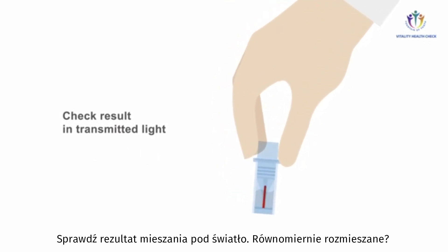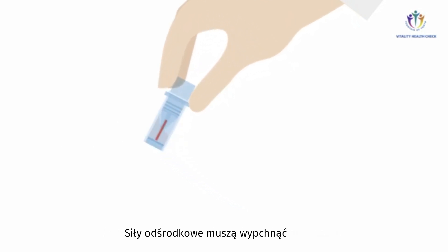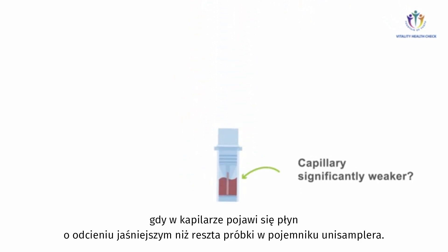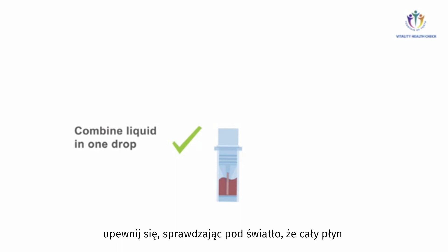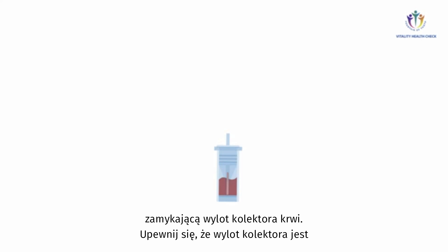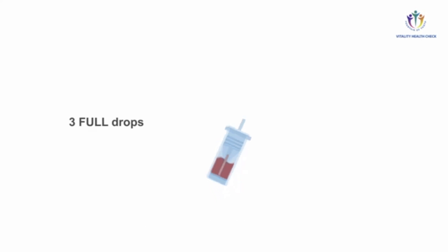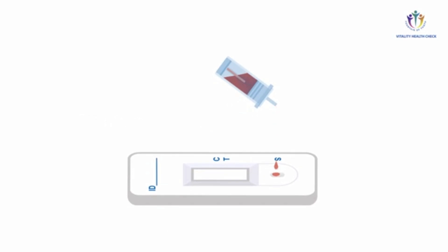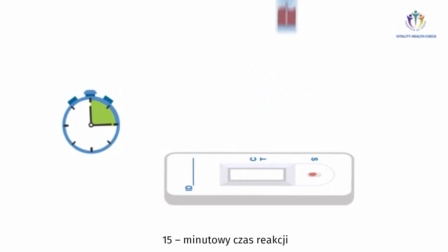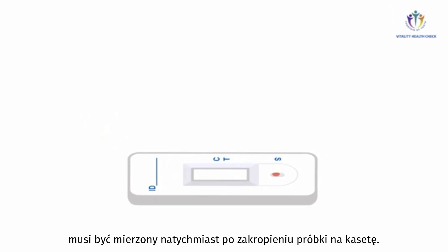Check the result in transmitted light — evenly mixed? Repeat mixing until this is achieved. Complete mixing is achieved once the liquid in the capillary appears stained weaker than the premix at the bottom of the collection tube in translucent light. Once mixing is complete, make sure all liquid is combined in one drop at the bottom of the collection tube. Remove the cap of the blood collector covering the sample outlet and verify the outlet is bubble-free. Place three full drops of the premix on the sample inlet S of the test cassette, ensuring sufficient distance to avoid the drop tearing off prematurely. The 15-minute reaction time until readout begins immediately after the premix is dropped on the cassette.